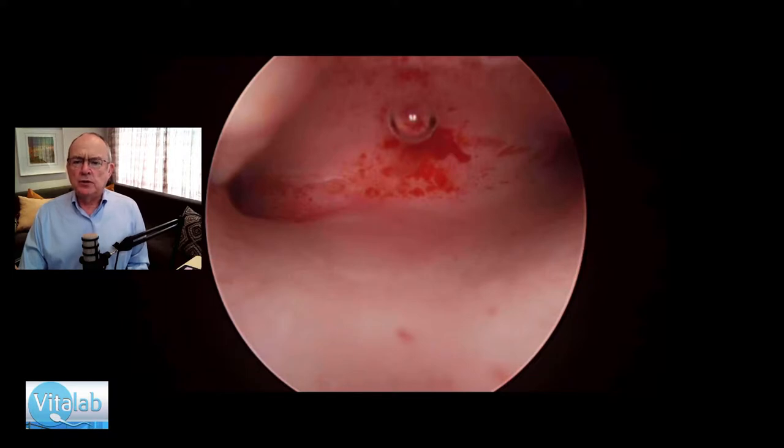It's my pleasure today to show you how I remove a Figo3 fibroid from the cavity hysteroscopically, utilizing the TruClear Medtronic Mechanical Tissue Removal System — specifically the Medtronic Ultra Hard Tissue Removal System.